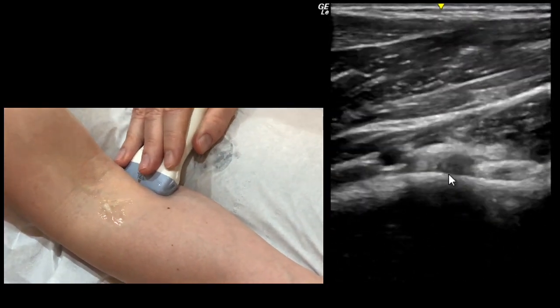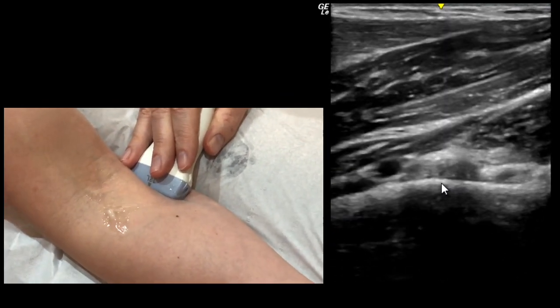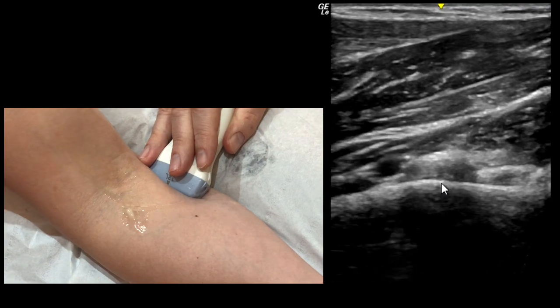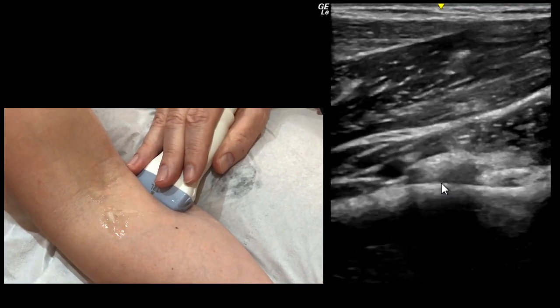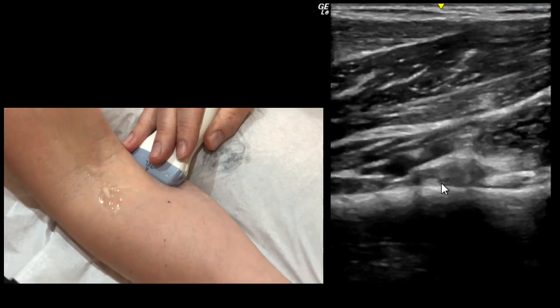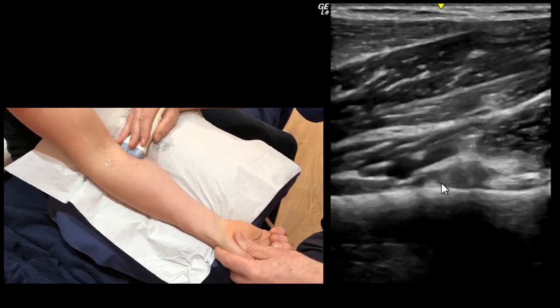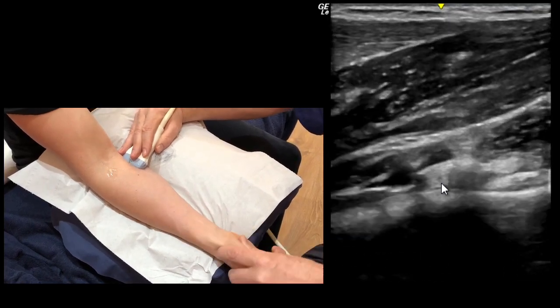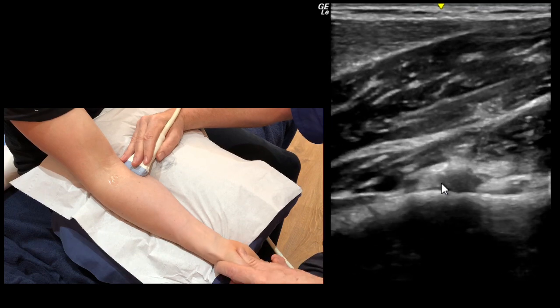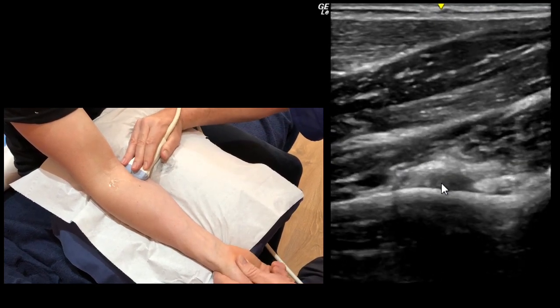This is the point where you really focus your attention. Get the bone horizontal and make sure you get rid of all the anisotropy. At this point, rather than trying to move around the tendon, you can actually supinate and pronate it and draw the tendon through your picture — that makes it much easier to control the anisotropy.